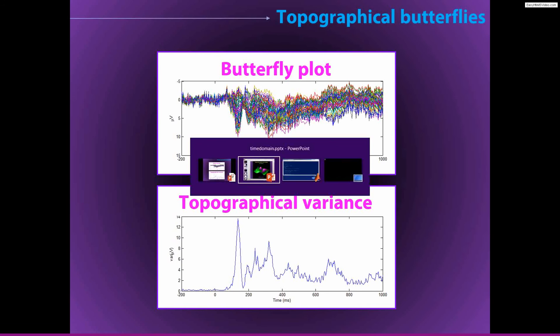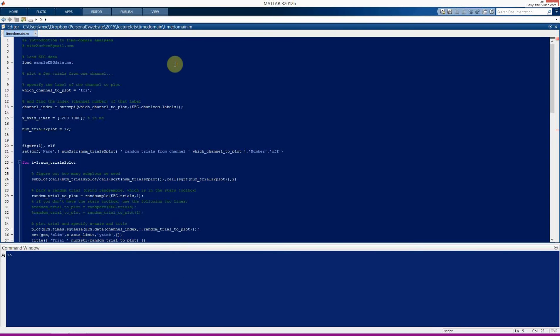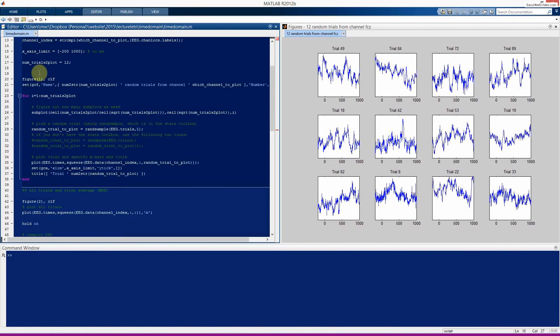So now we'll switch to MATLAB very quickly, so you can see some code that will generate some of these figures. If you run this first cell here, we define a channel that we're going to use to plot, in this case I chose FCZ, but you can change it to whatever other electrode. Here, we define an x-axis limit, just for fixing the plots.